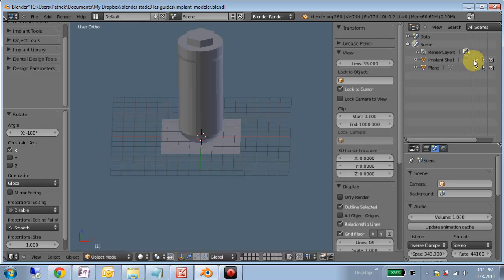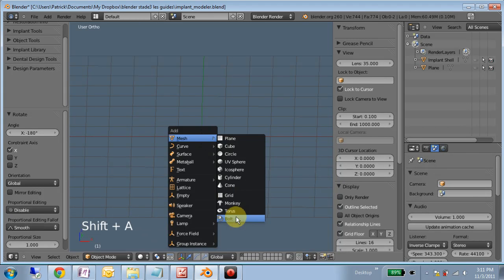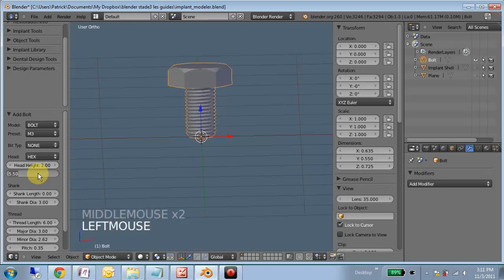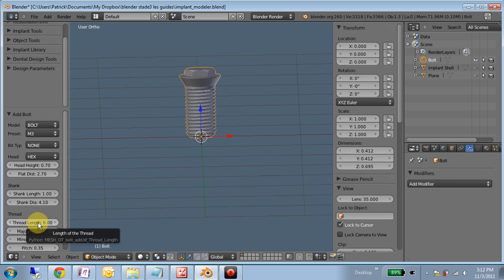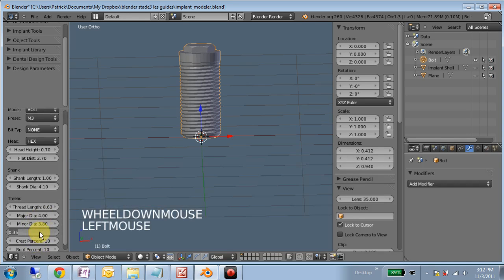Okay, so I'm going to hide our shell, hide our plane, and just show you some of the features of the bolt factory add-on. We take a look at this bolt, and let's just try and model the implant that the shank would correspond to the collar. Collar is 4.1. So 9.63 minus 1 would be 8.63 for the body. Major diameter would be 4. The minor diameter we're not sure, but 3.8 kind of makes it look good. Pitch 0.6.